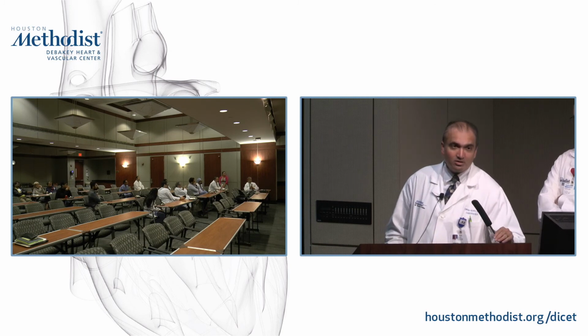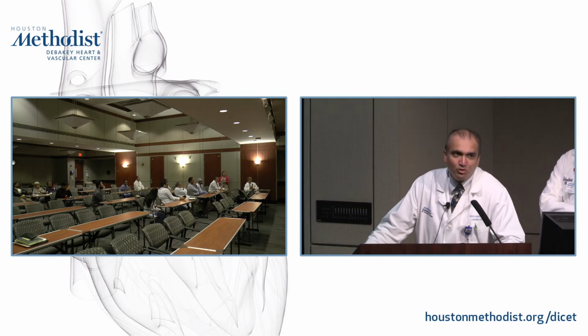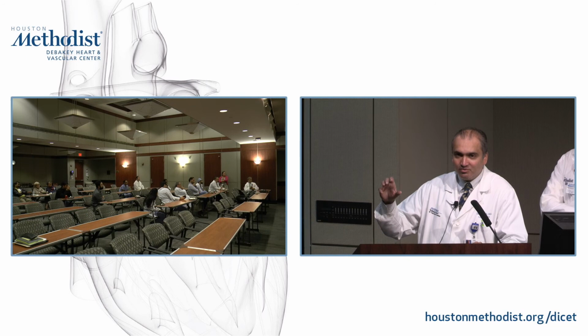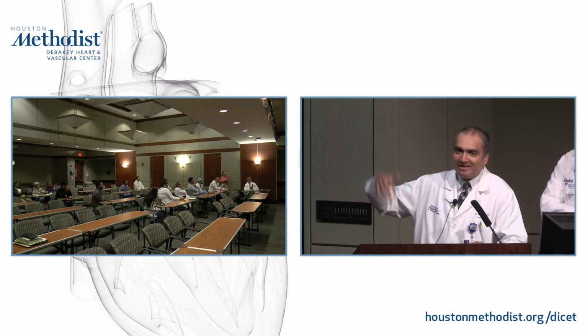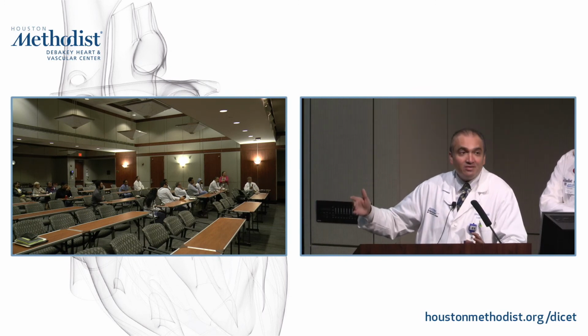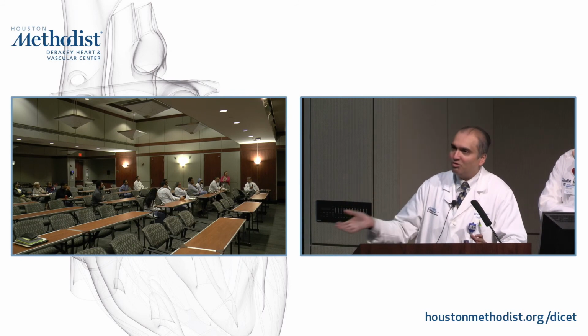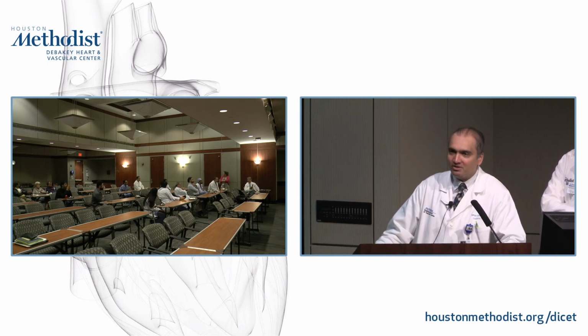Yeah, and just to echo that, as we start doing more of these liver patients, you need to keep in mind that regurgitant fraction can be tricky, because you could have somebody with AI who is a liver failure patient with a very high baseline flow rate. They may have 60, 70 cc's of reverse flow, but the fraction turns out very low because their total volume is just so high. So exactly, I think you're right. When you get high regurgitant volumes, don't get misled by seeing a low regurgitant fraction.